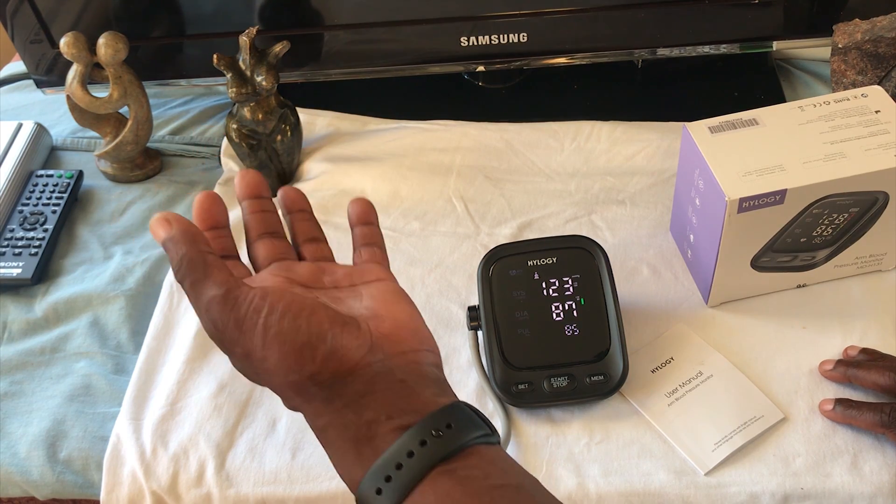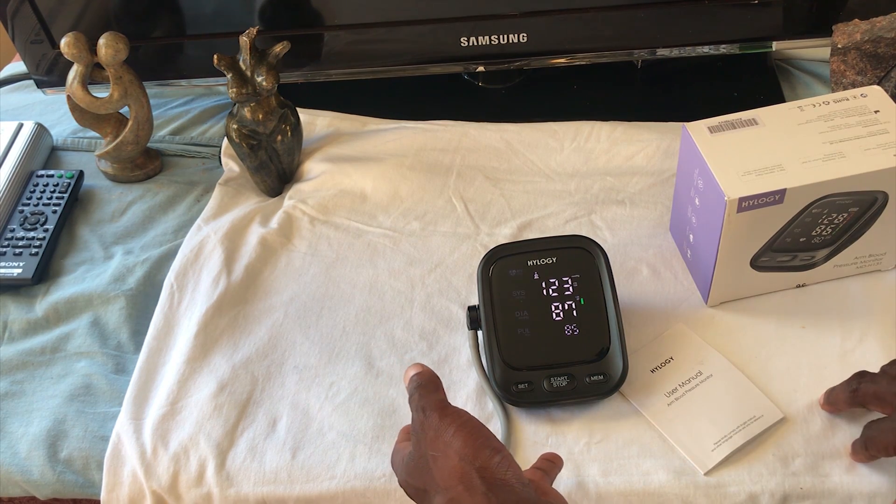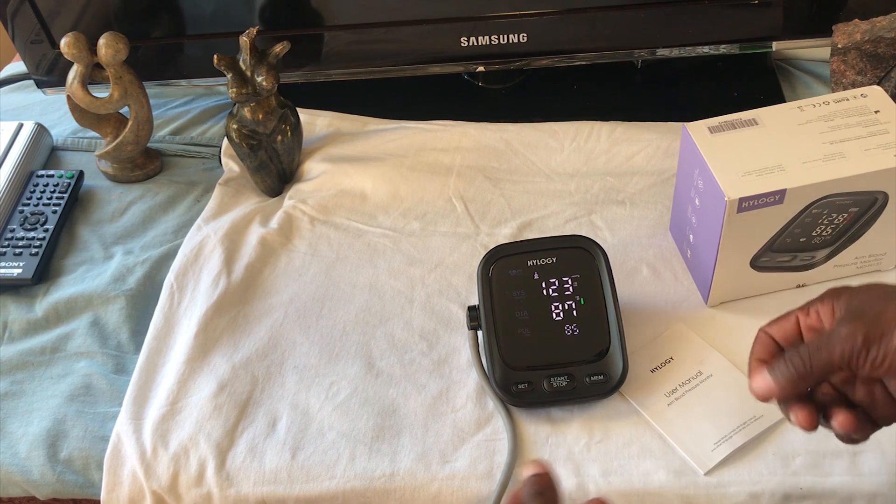A slightly different reading, but not too different from the one I did with my arm rested. So I'm just going to switch over to get on screen and talk about the device itself.